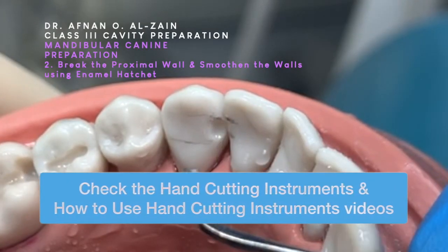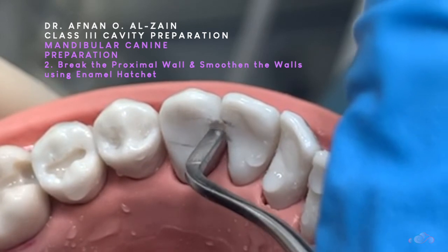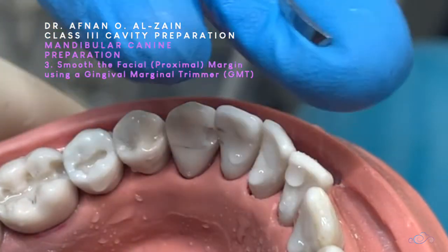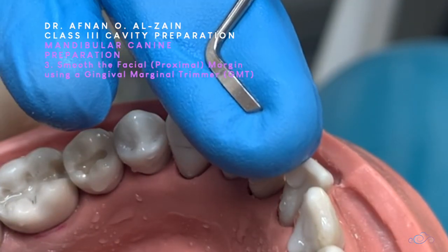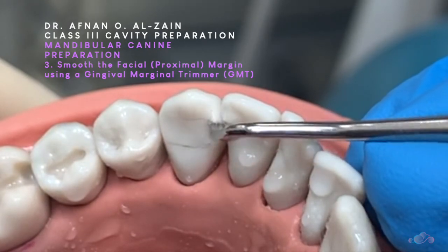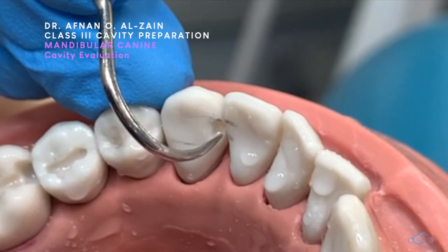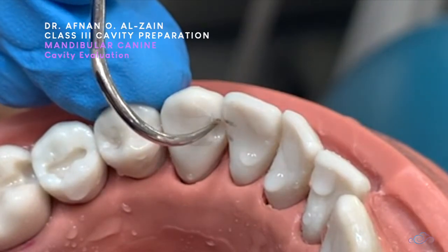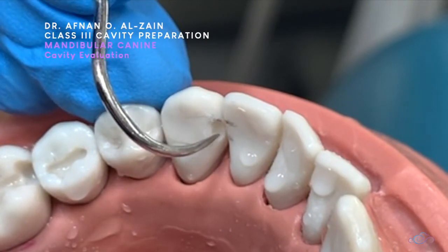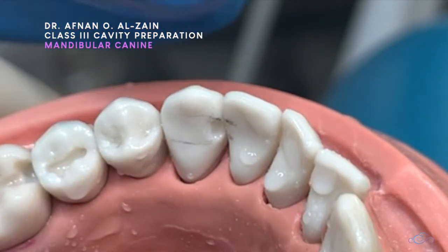We'll take the hatchet and push it against the walls, like for class two. Then we'll use the GMT, placing it against the facial margin or the proximal margin and do a scraping action. After that, we're going to check that the cavity is box-shaped within the middle third of the tooth. We did not involve the incisal angle and it is very smooth. This is how we prepare a class 3 cavity in a lower canine.